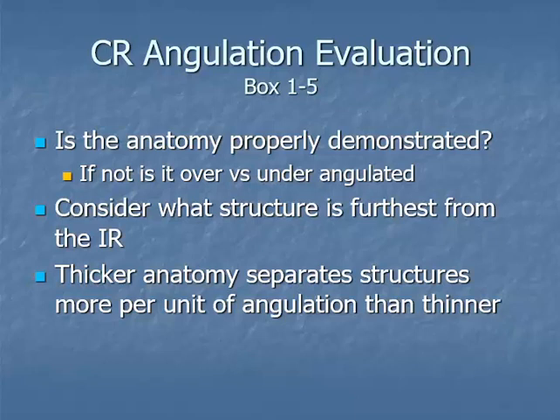So, pre-exposure, we need to evaluate our patient and determine how much rotation or how much of an angulation we'll need. If you think all the way back to the first semester, whenever we were doing clavicles, the purpose for the apicoaxial clavicle was to project the clavicle above the apex of the lungs. That didn't take a whole lot of angulation with a hypersthenic patient or a patient with a big, thick barrel chest, but whenever we had an asthenic patient, it took more angulation. So that's kind of what we're looking at there.